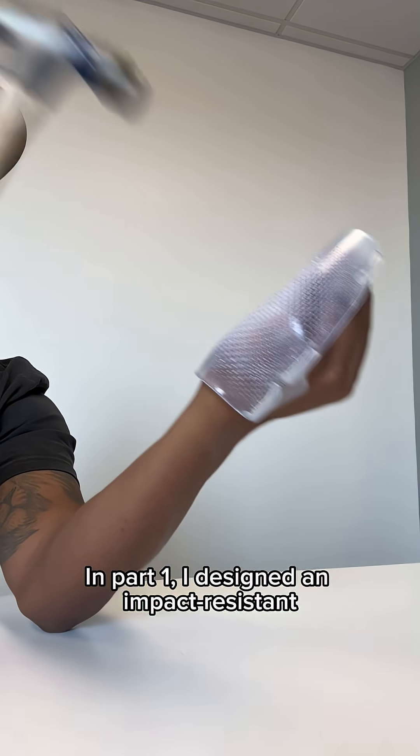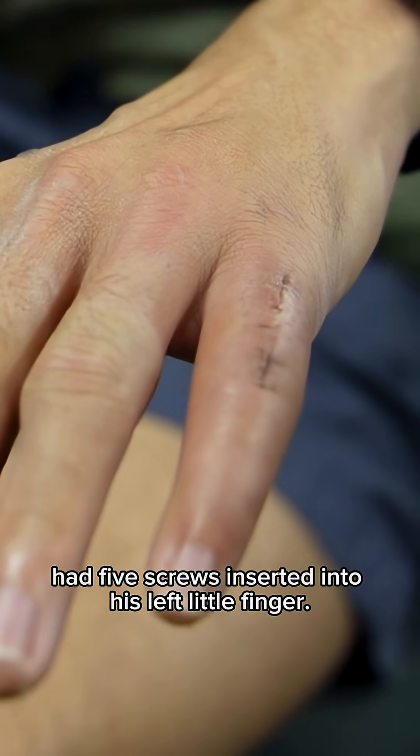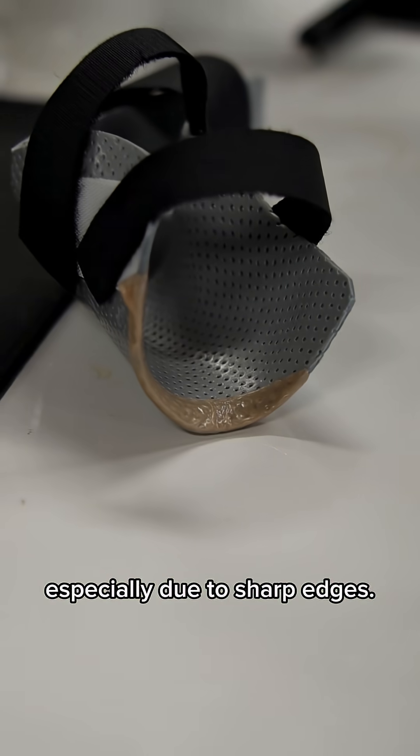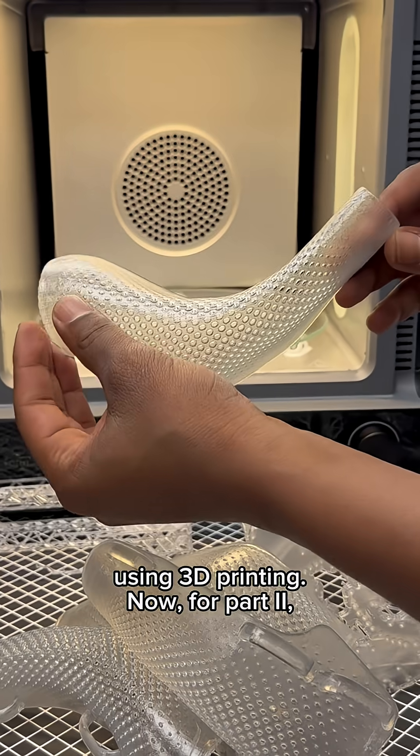In Part 1, I designed an impact-resistant resin 3D printed orthosis for a colleague who recently had five screws inserted into his left little finger. His previous orthosis worked, but it caused discomfort, especially due to sharp edges. So we discussed running some comfort tests using 3D printing.